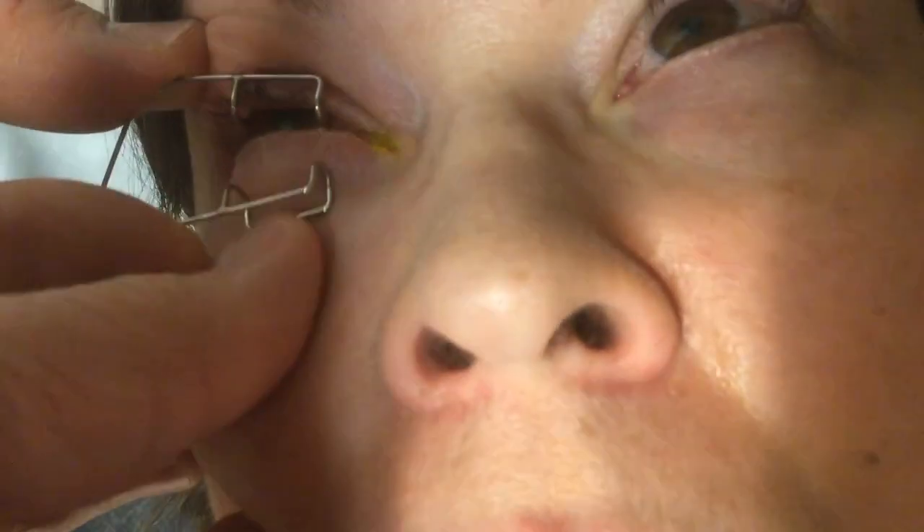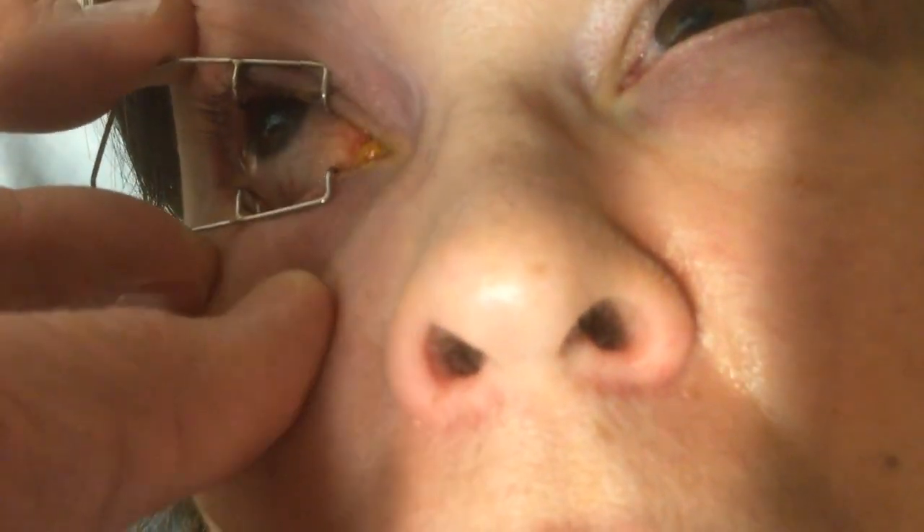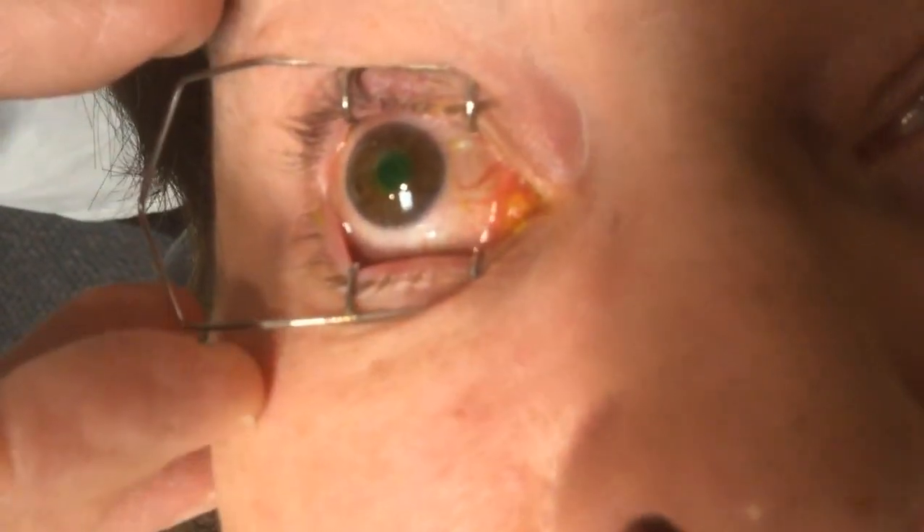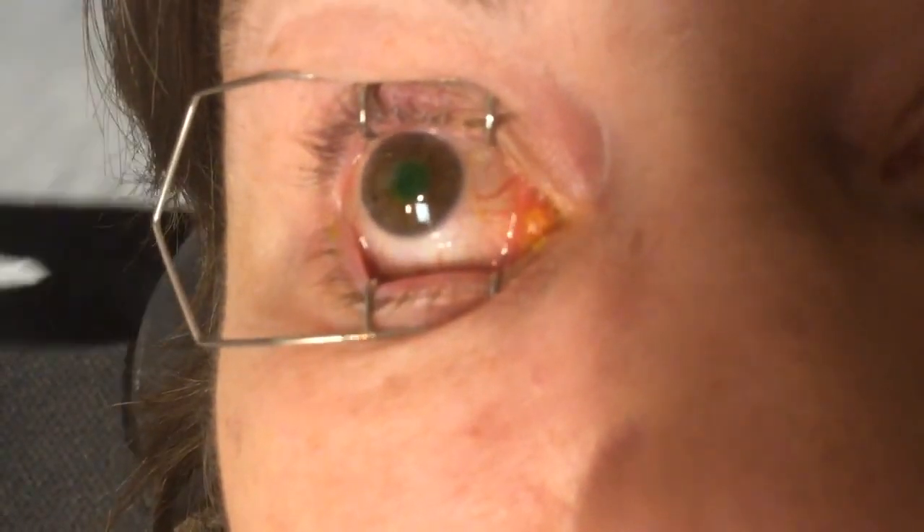So my hands are in the way, so I'm going to have you look down. Look up. Look down again. Make sure you get it on the right there. Okay. And look up. Straight ahead. Did great.